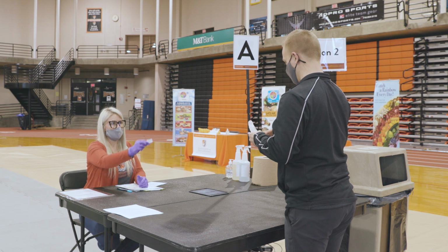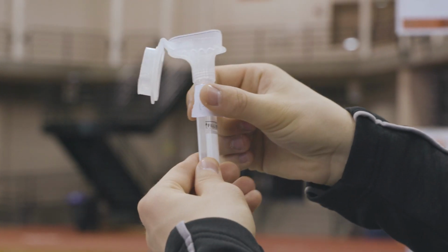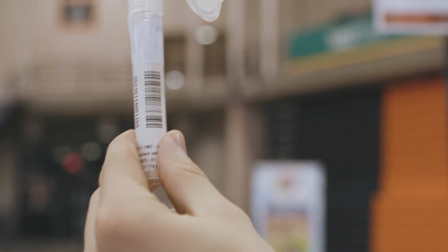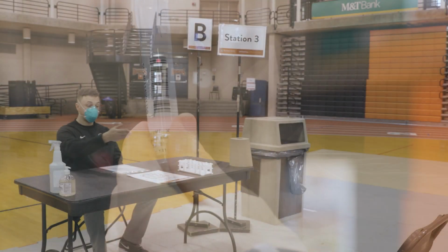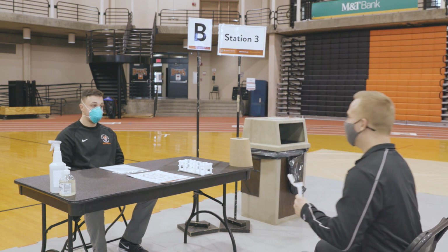The attendant will provide you with a label with your name and date of birth. Place this label above the barcode on the testing tube and move to Station 3. The attendant at Station 3 will then prompt you to lower your mask and give your saliva sample. Make sure your sample reaches the fill line on the tube.